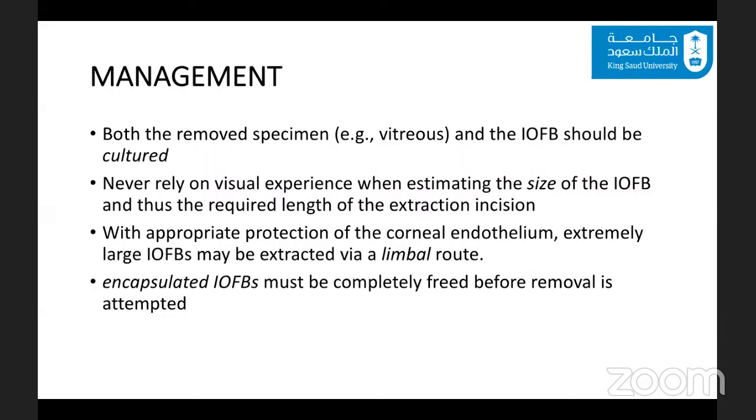So after you remove the specimen, obviously you need to send the vitreous and the intraocular body for culture. And a lesson to learn is never to rely on visual experience when estimating the size of the intraocular foreign body, and thus the required length of the opening you need to incise in order to extract the foreign body.